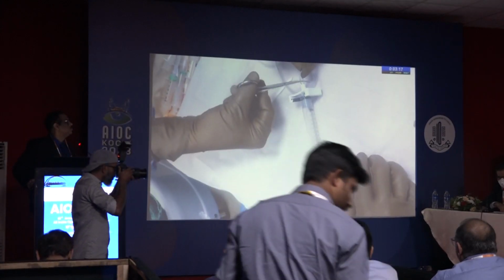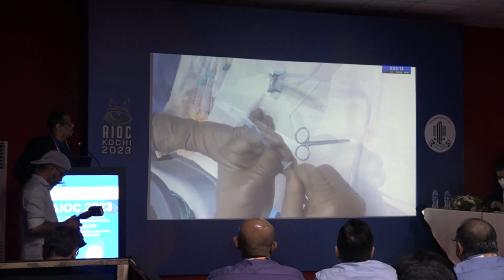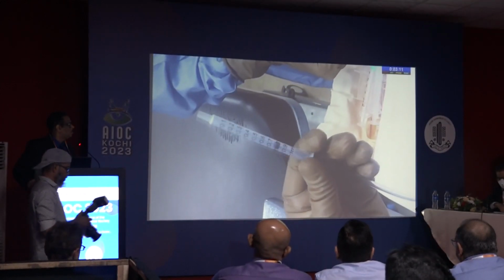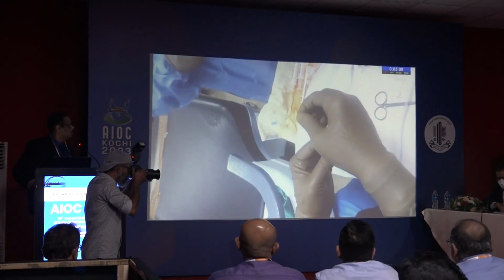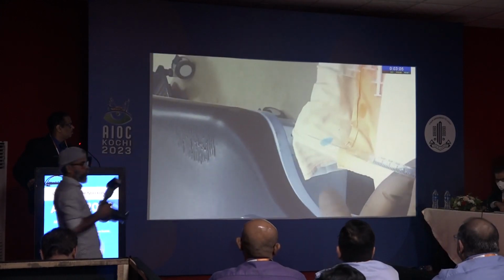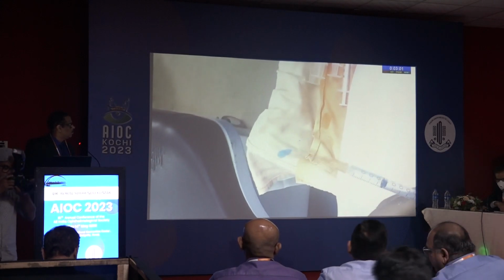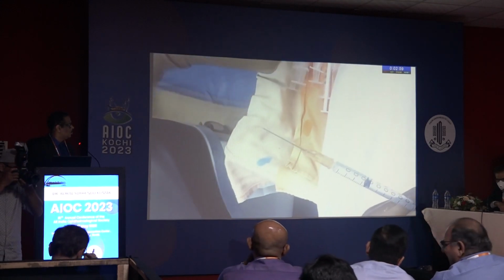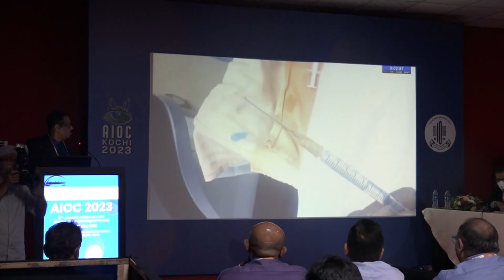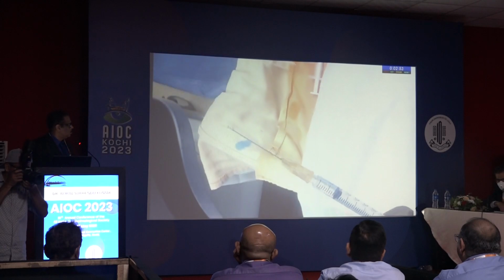Its end was fitted with the tubings of the VFC of the vitrectomy machine. Now VFC mode was activated. Attaching either a 38 gauge or 41 gauge subretinal needle to the syringe to extract the retained submacular PFCL bubbles or to deliver a precise dose of subretinal drugs like RTPA for subretinal hematoma in a controlled way.